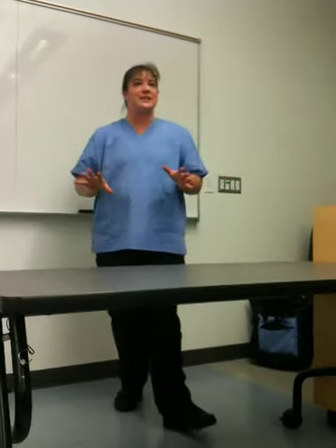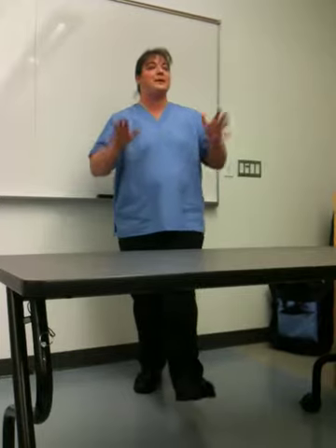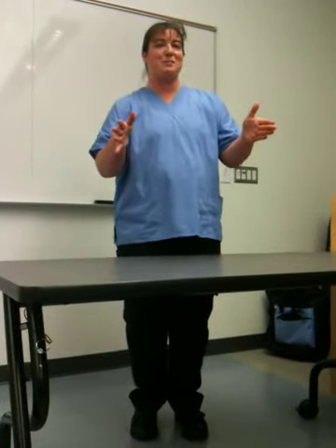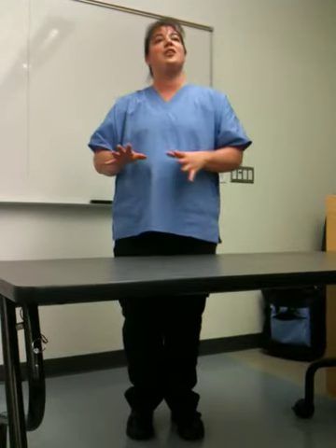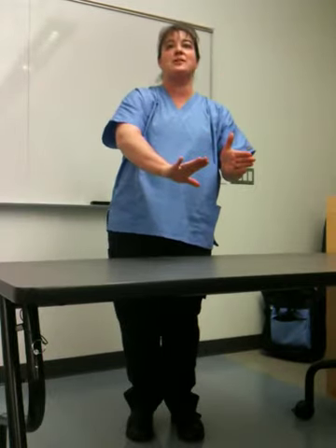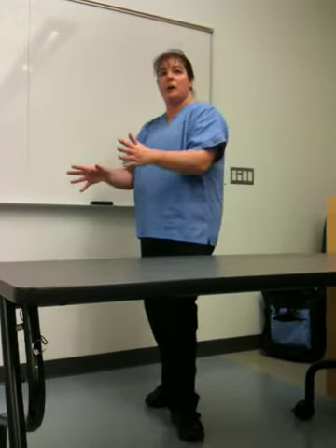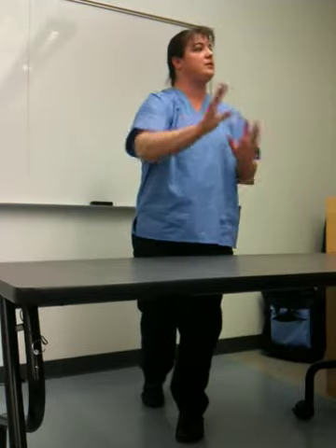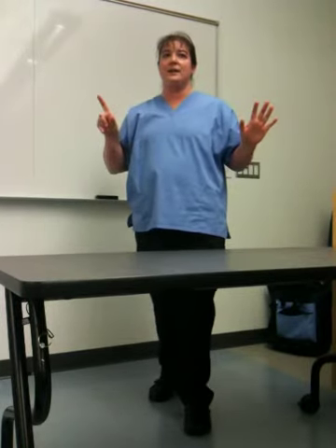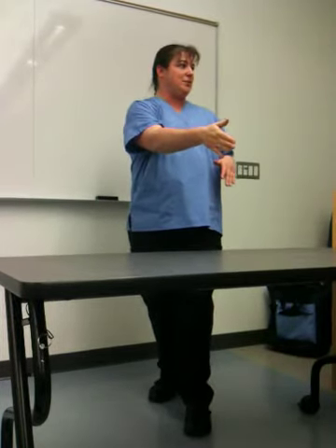So when you first enter the scene, you're simply going to walk up. Did you see this happen? How long has the patient been down? How long has CPR been going on? You're going to then say, okay, I'm going to have my partner jump in and begin compressions on this patient. Power on, attach the electrodes, stand clear, analyzing, stand clear, shocking, push the button. All right, back to chest compressions immediately.